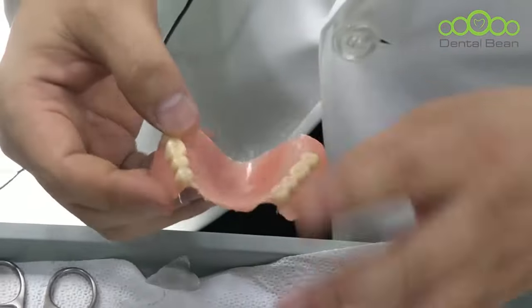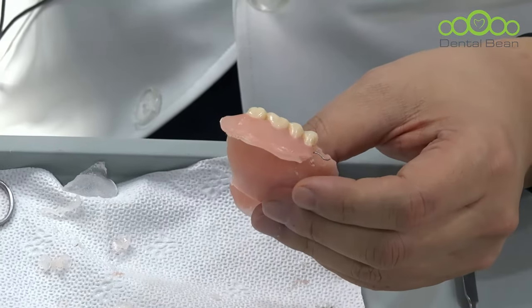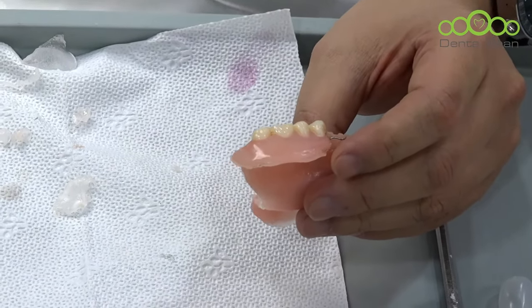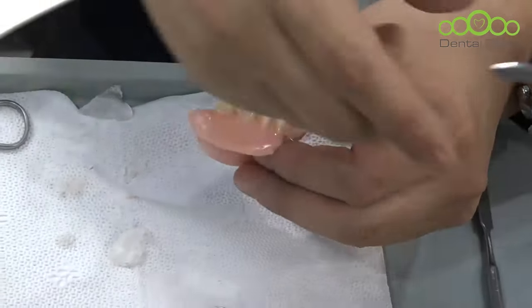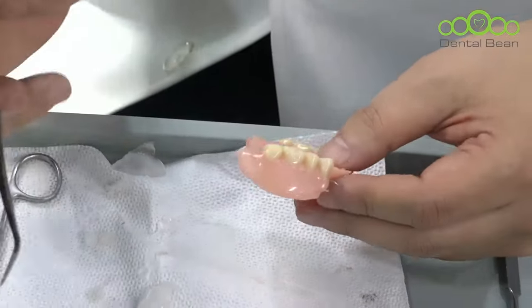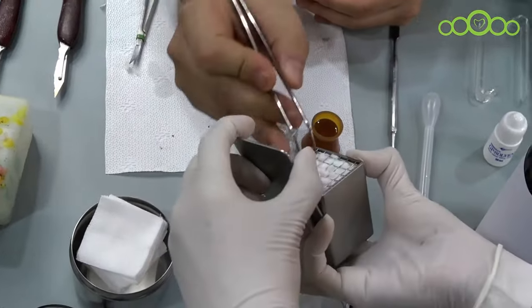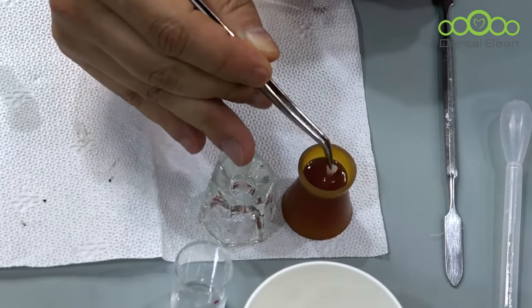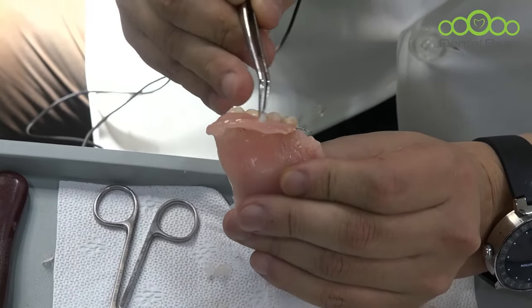And at this moment, I often use the pincet. Please give me the pincet. Often use the chloroform or the GP solvent. And please prepare the cotton pellet. And this is dipped into the chloroform or GP solvent. And then you sweep out like this.